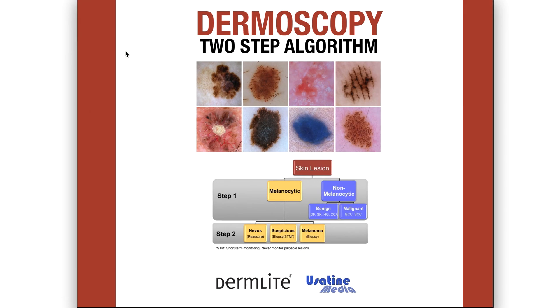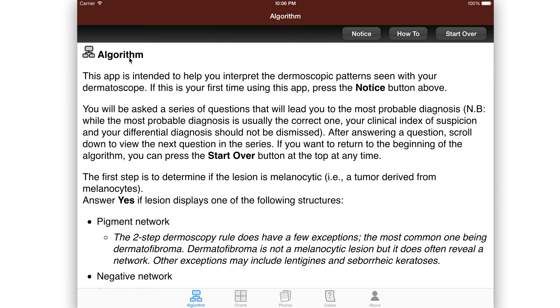Usatine Media presents Dermoscopy Two-Step Algorithm. This is an app that is completely free to all of you. It shows how to use the two-step algorithm to interpret dermoscopy patterns seen with your dermatoscope.